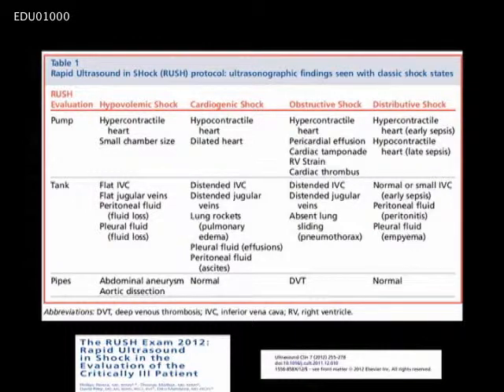As we described, this is a three-part evaluation, beginning with Part 1, Evaluation of Tank Fullness, which is an examination of the inferior vena cava and internal jugular veins to assess central venous pressure. Part 2, Evaluation for Tank Leakiness and Overload, is performed by the extended FAST exam to look for free fluid within the abdomen and pelvis, as well as to look for the presence of ultrasonic B-lines indicative of pulmonary edema. The last part of the tank assessment is to look for tank compromise, or the presence of a tension pneumothorax indicated by the lack of lung sliding and the lack of positive comet tail artifacts.